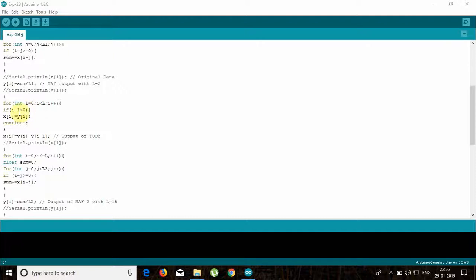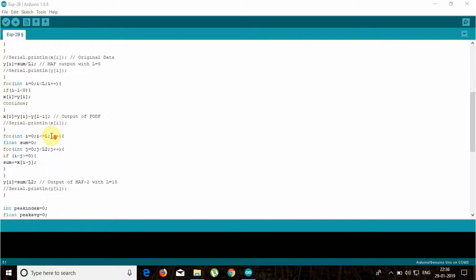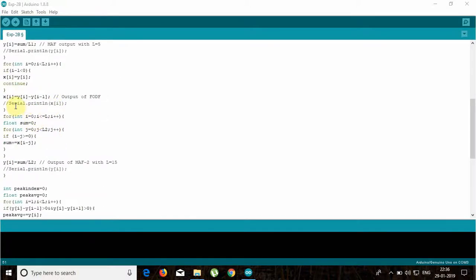So in this loop, we will calculate the output of the first order derivative filter. This expression calculates the output of the derivative filter, and then we can plot the output of the first order derivative filter with this command.